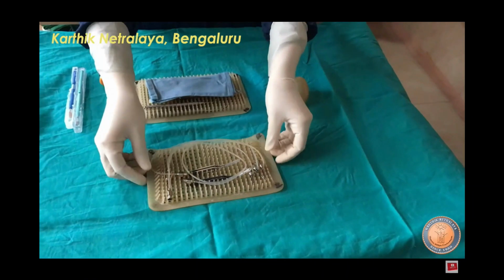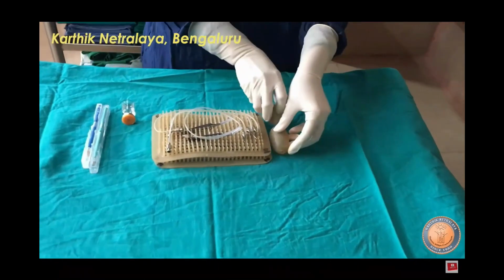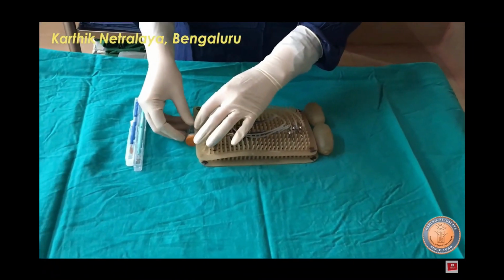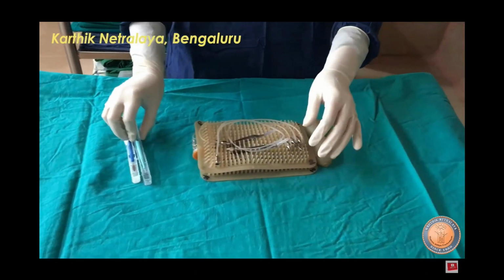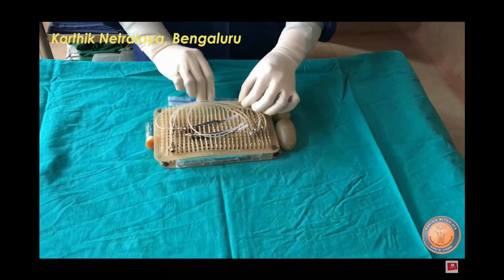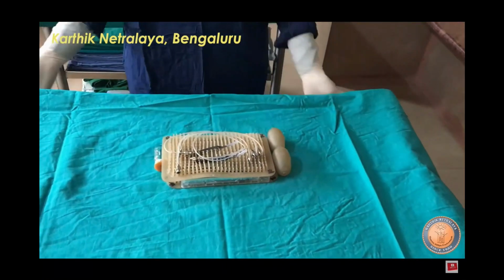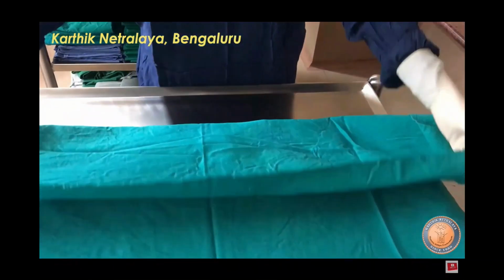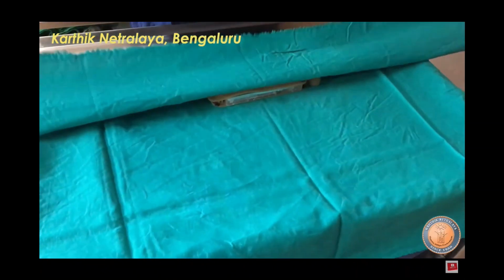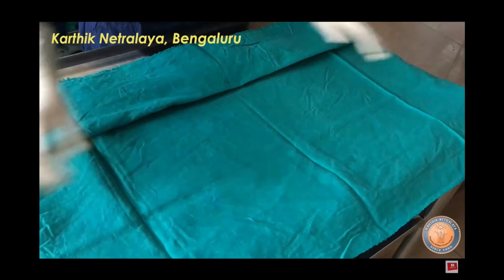silicone mats, as you can see there, and they're double decker, and there's no box. We don't use a box. That's the viscoelastic, and that's the sharps. So that forms the entire set that you need to do a cataract surgery, and that's how she's going to pack. And that's the first pack. The first pack is getting ready right now.